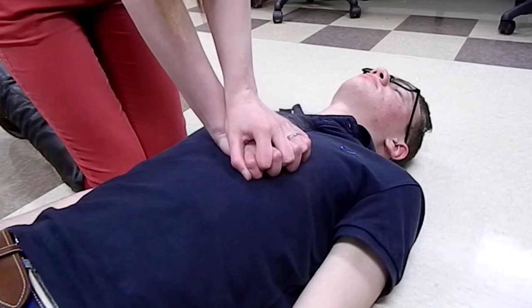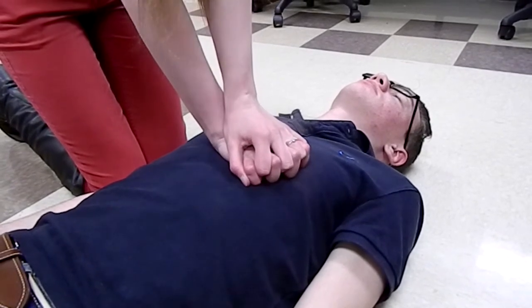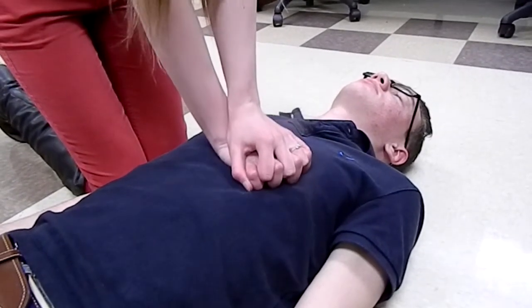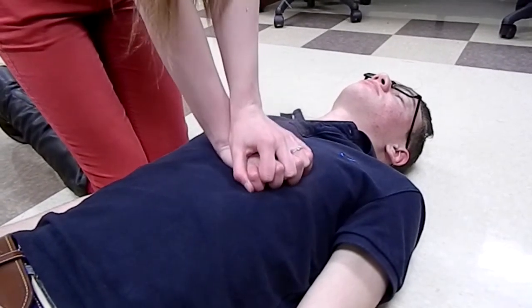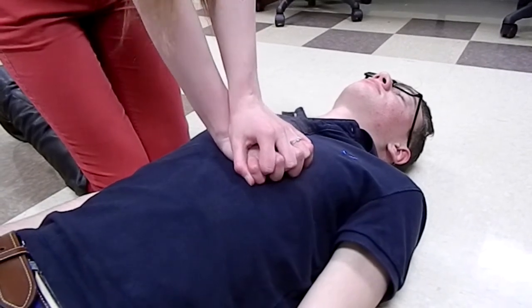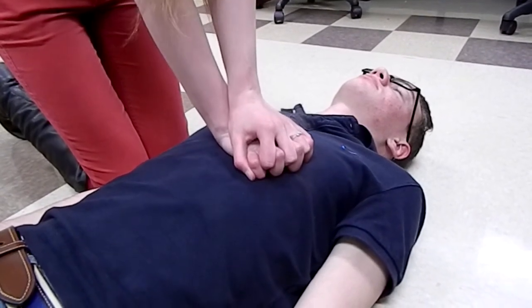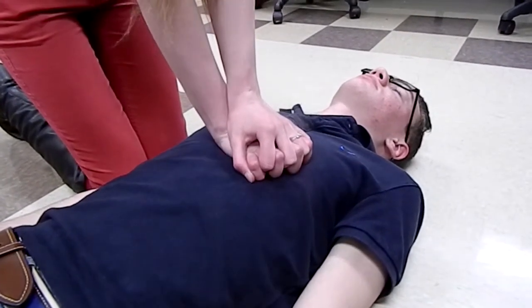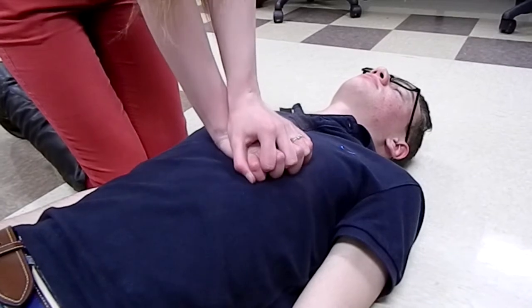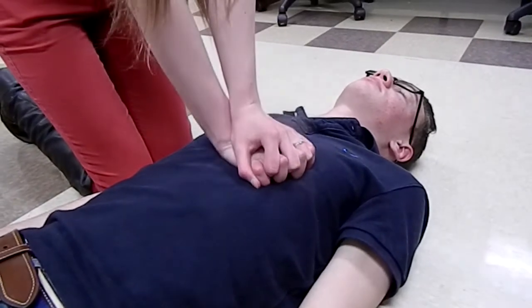CPR will not save someone's life alone. An AED is needed to restore normal heart function. However, never cease compressions for more than a few seconds after starting. This keeps blood and oxygen flowing to the body, and most importantly, to the brain.